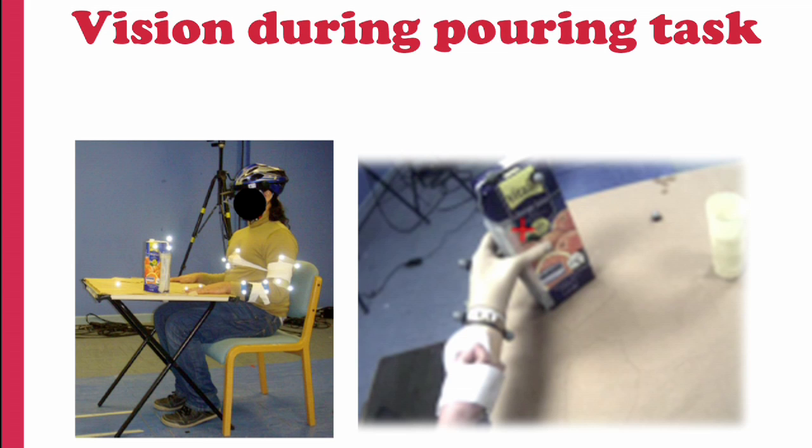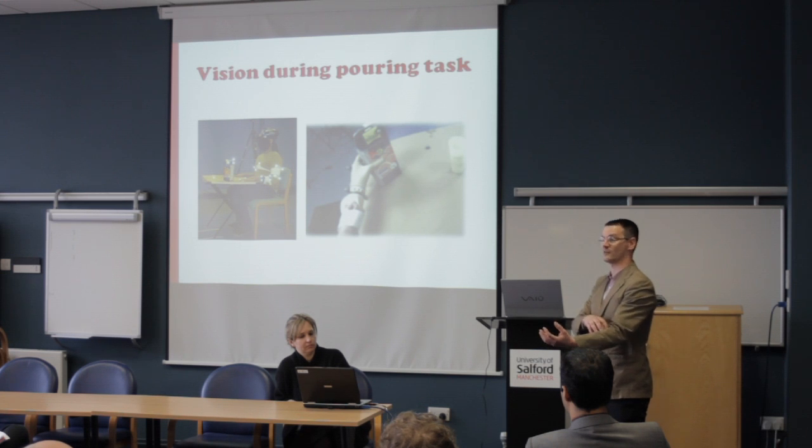We've actually studied this in the laboratory using gaze tracking. And we find that the amputees spend a lot more of their time paying attention to where their arm is, which means that their movements are very effortful. So one of the goals of the training is to make the movements more automatic and less effortful. And previous applications have tried to develop a kind of gaming environment to help train the prosthesis users so that their actions become more automatic.